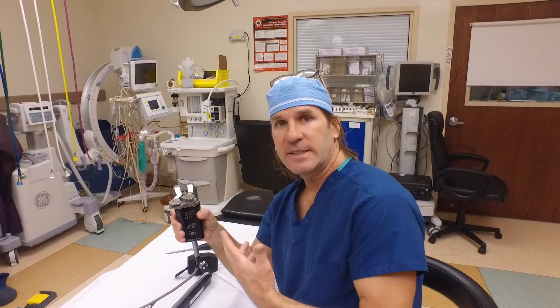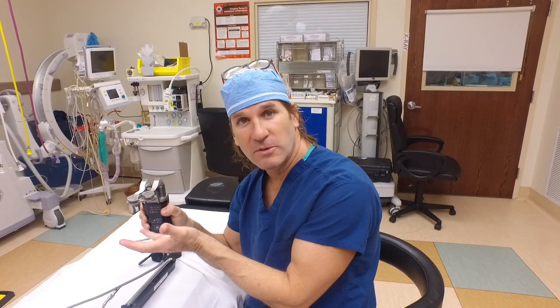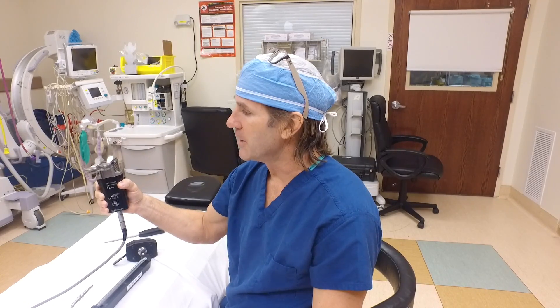This is the actual tensioning device of the robot. It uses these little paddles right here. We put it between the bones, activate it, and it'll push up with whatever predetermined amount of newtons I tell it to do. It'll measure the gaps and tell me how tight the ligaments are on each side.